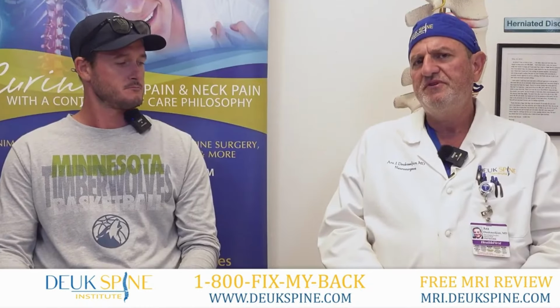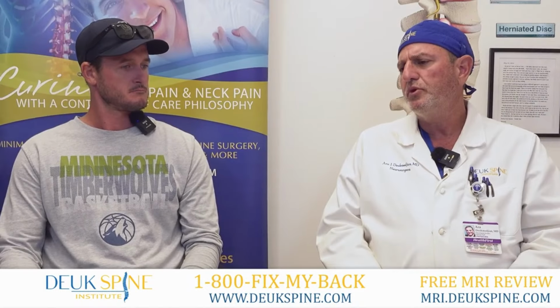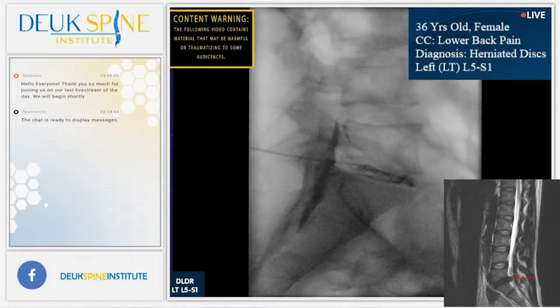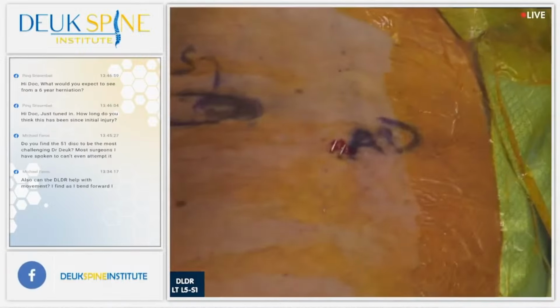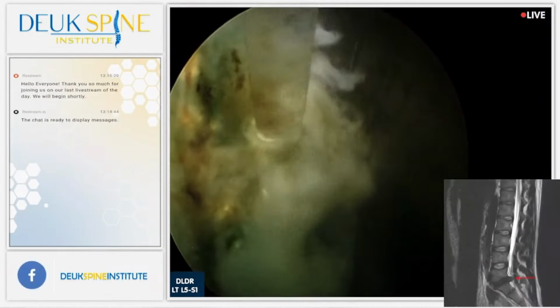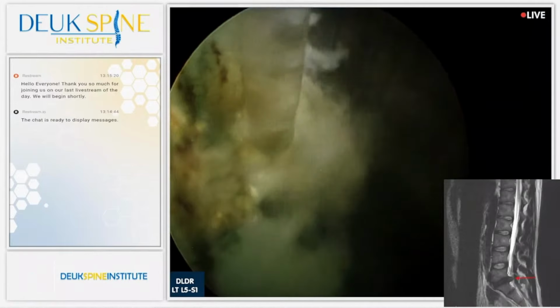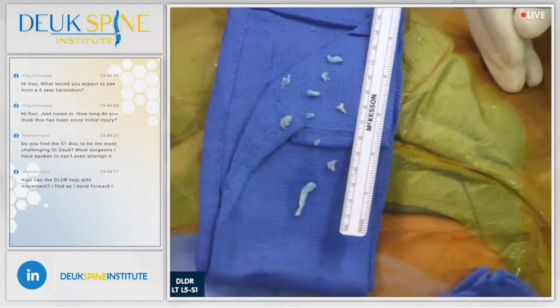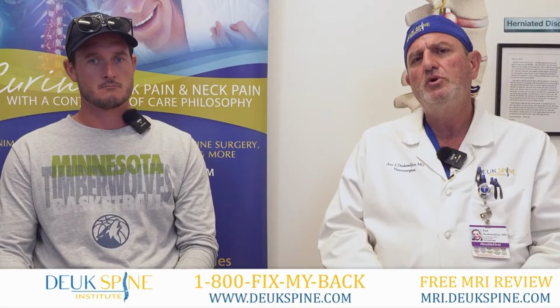You came to us and we found weakness also. You had weakness pulling your toe up. That's because the nerve was pinched so bad at L5-S1. You can see here on the video, we went in with a tiny Band-Aid incision, 1/4 inch. We went in and basically removed most of the herniation, cleaned up the tear where it came out of so that the tear will now heal. Your disc will heal naturally. And we did it all without removing bones or ligaments.